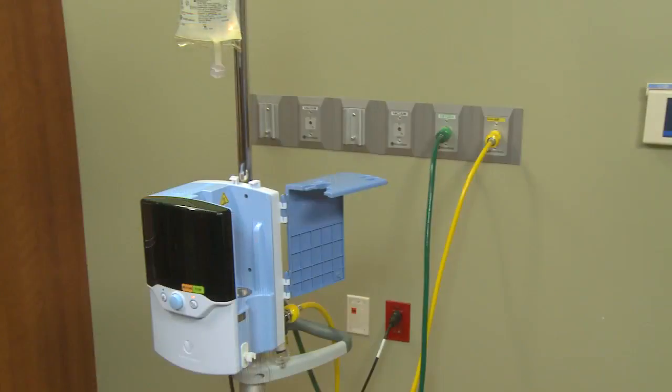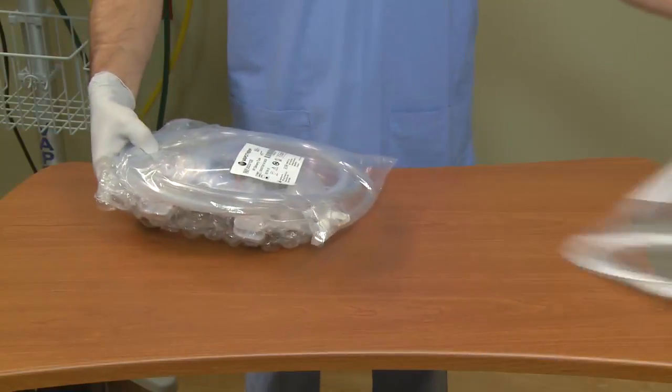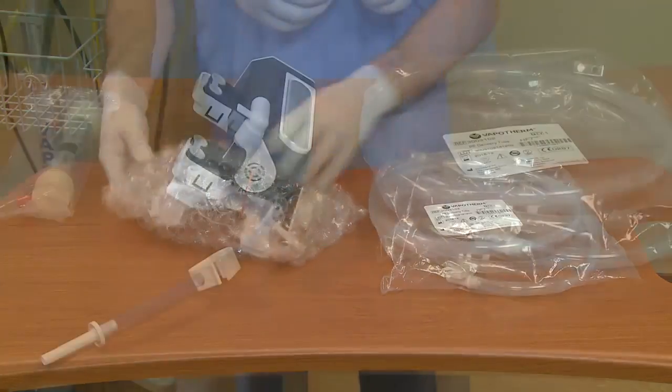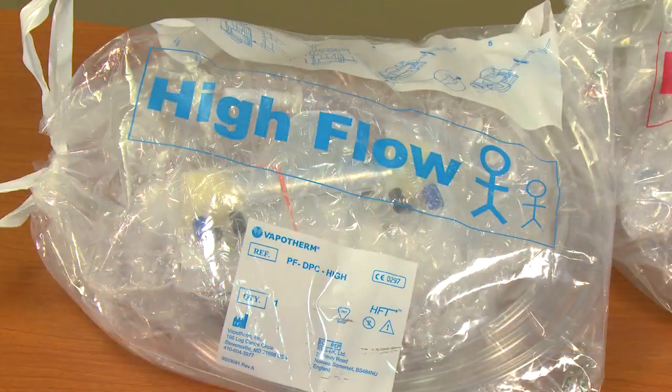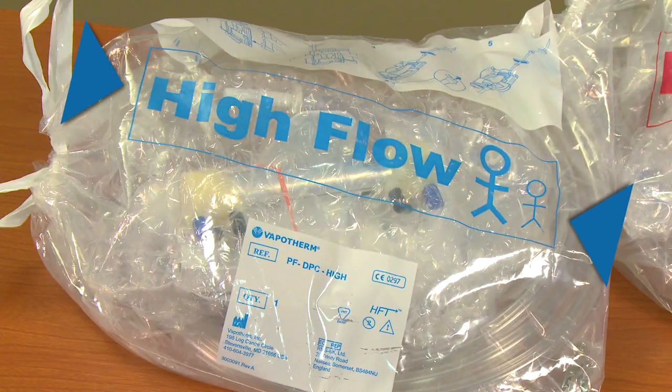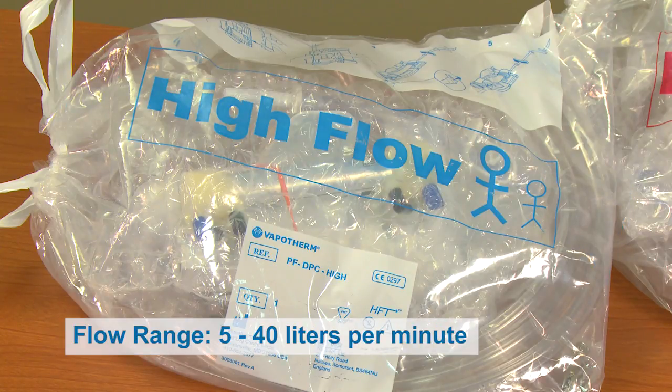With the Precision Flow unit set up, it is now time to assemble and insert the disposable patient circuit. You will need a sterile water bag, a properly sized nasal cannula, and a grab-and-go DPC kit. Each grab-and-go DPC kit contains three components: the vapor transfer cartridge or VTC, the disposable water path or DWP, and the patient delivery tube. The kit marked with large blue lettering stating high flow setup is specific for both pediatric and adult patient populations, to be used with adult and pediatric cannulas, with a flow range of 5 to 40 liters per minute.